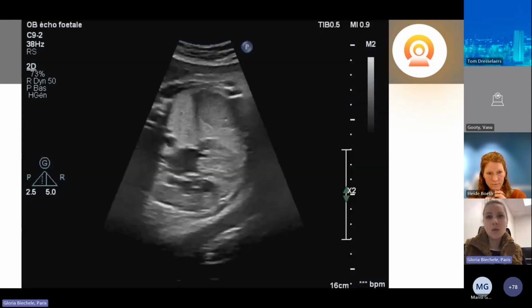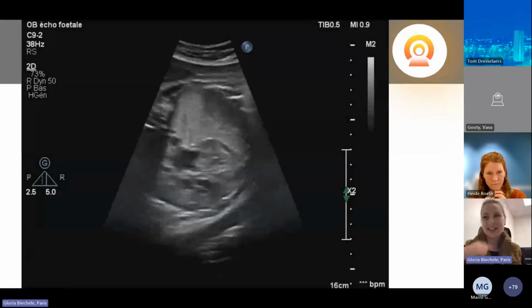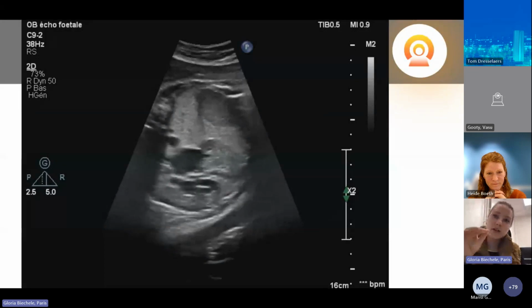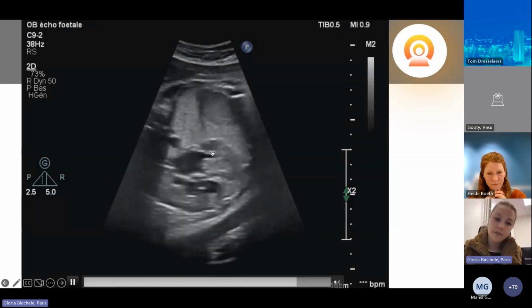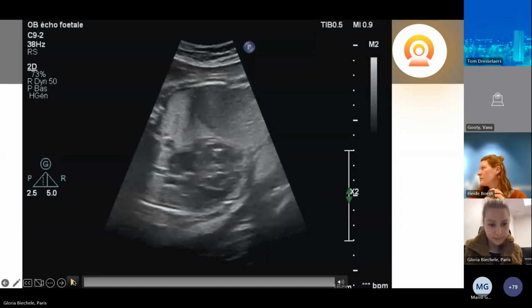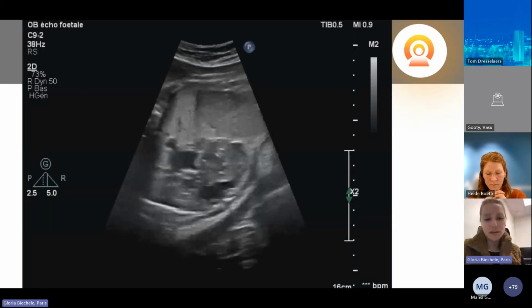So we let the pregnant woman turn from one side to the other and back once again to get the best possible position to perform the ultrasound and to make the fetus maybe turn a little bit. And this was already a little better. So you can see the thickened myocard walls here of the left ventricle, but already not perfect. Oh, I'm sorry. I hope this works. Yeah. Then we have caught, I think, quite a good moment here.